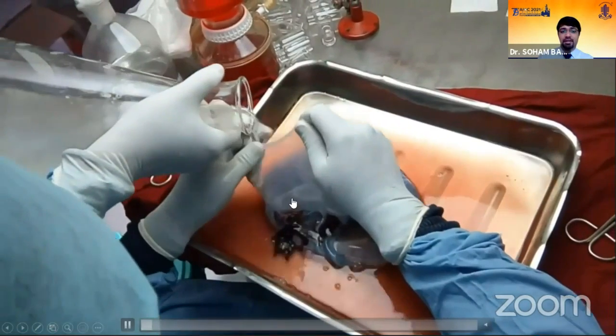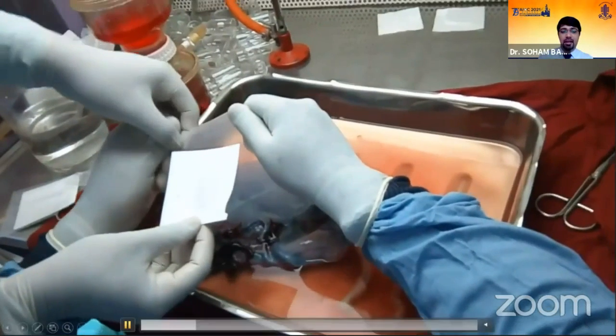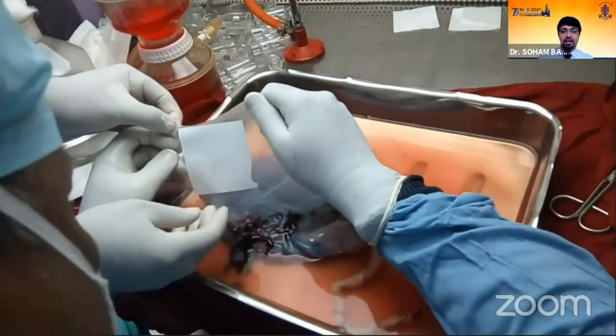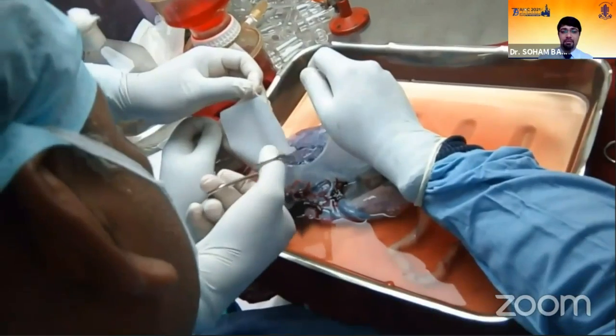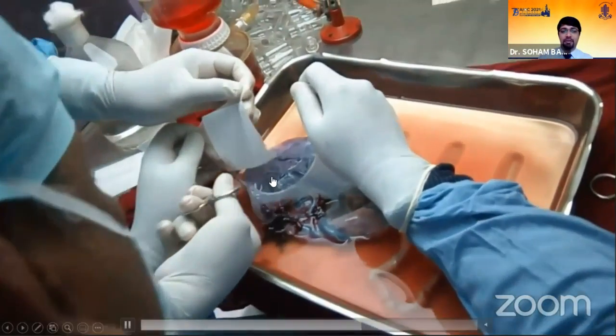After separation, again, the amnion is individually washed thoroughly. And then finally, we apply these cut pieces of nitrocellulose paper. This has been cut into 3 × 3 inches. Then further, we will be stripping it down to size. Once the nitrocellulose paper has been stuck, we take sterile scissors and cut the amniotic membrane. Then this becomes a carrier which has the amniotic membrane on it.